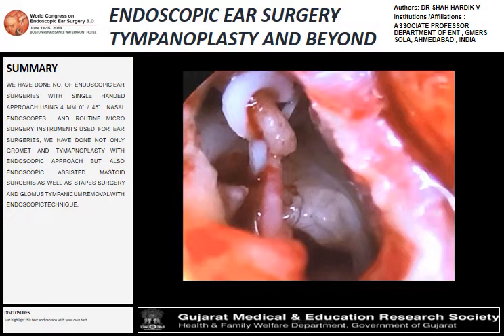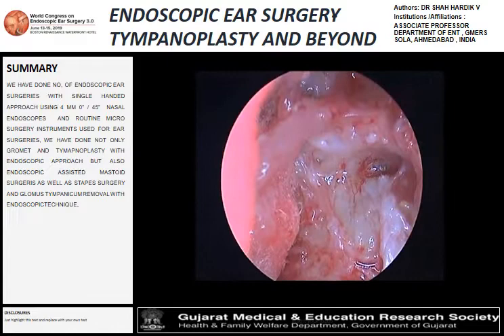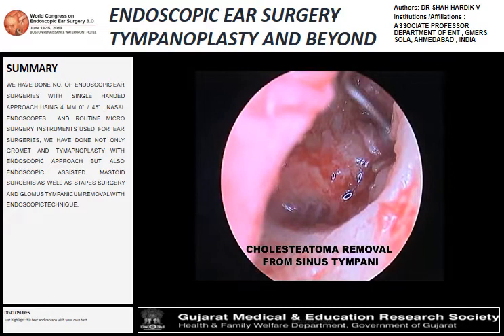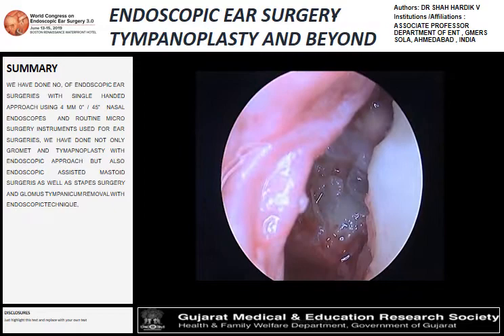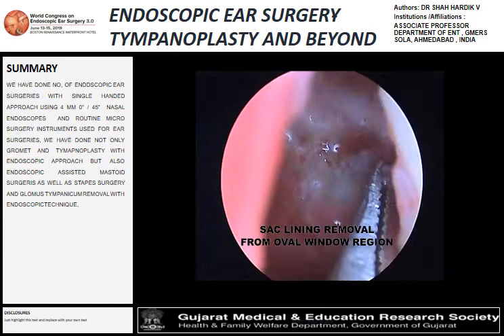Next, the procedure is cholesteatoma removal with the help of the endoscope. This patient underwent a post-aural approach with great visualization of the sinus tympani and mesotympanum, with the facial recess and removal of the sac. Using the endoscope in the mastoid approach, we were able to avoid a canal wall down procedure.